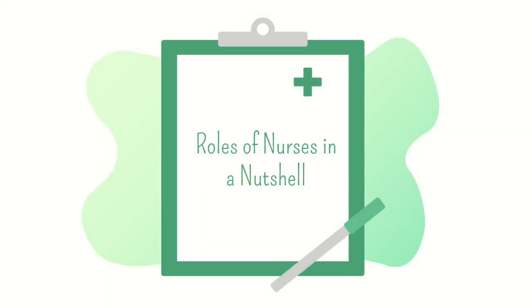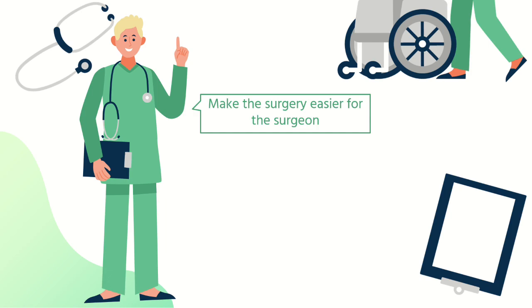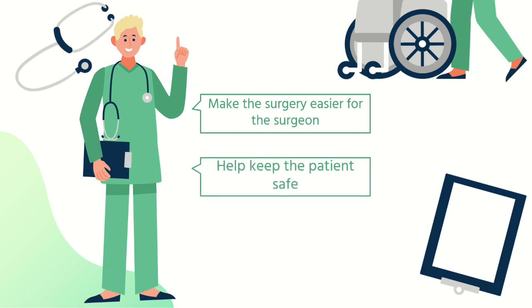So what are the roles of a nurse in MIS? So, to simplify it, us nurses need to make the surgery easier for the surgeon, always help to keep the patient safe, and take care of the machines and instruments.